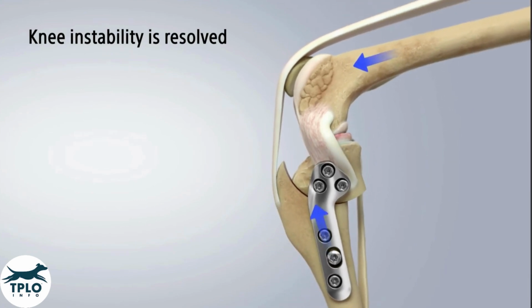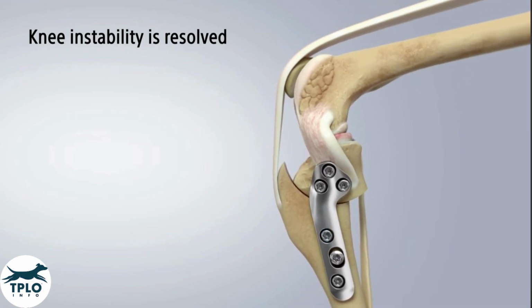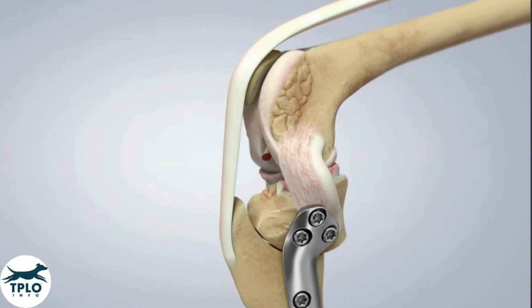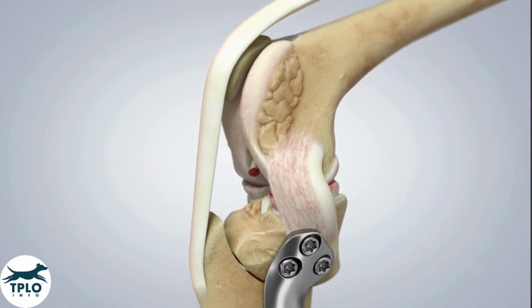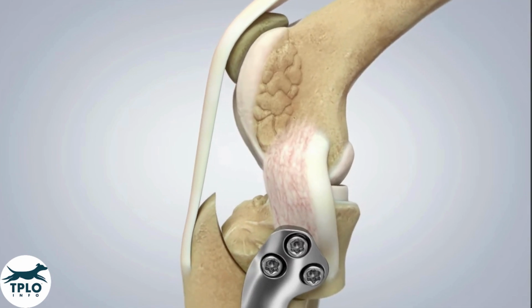Now, as forces go through the dog knee, there is no longer cranial tibial thrust. Existing arthritis cannot be removed. However, this new stability will reduce progression of future arthritis.